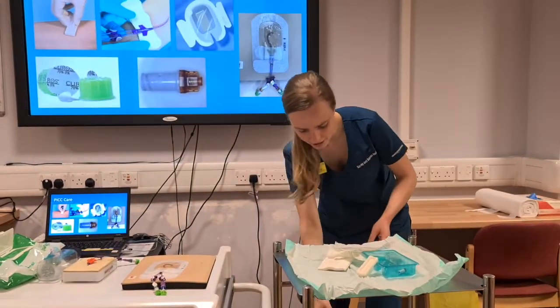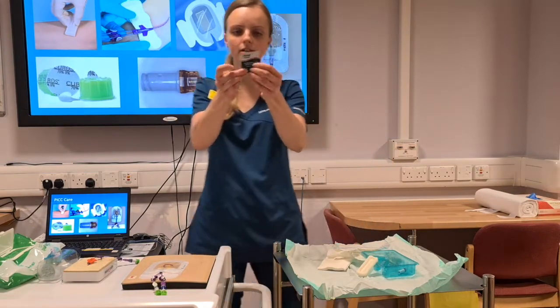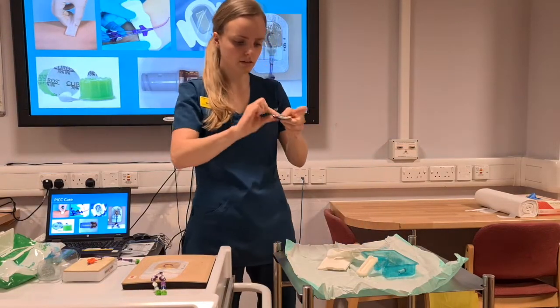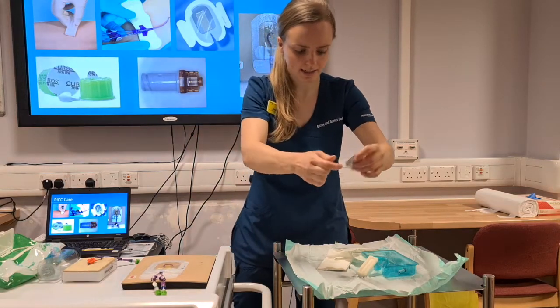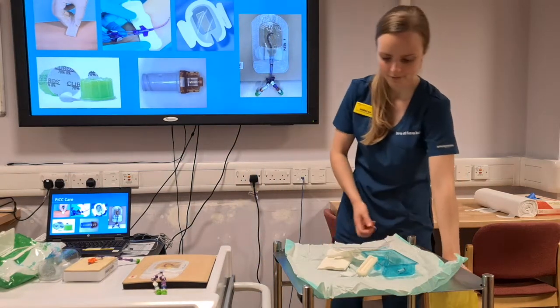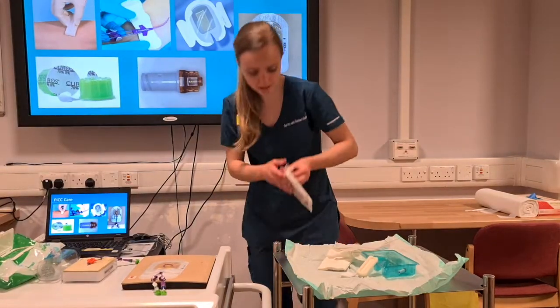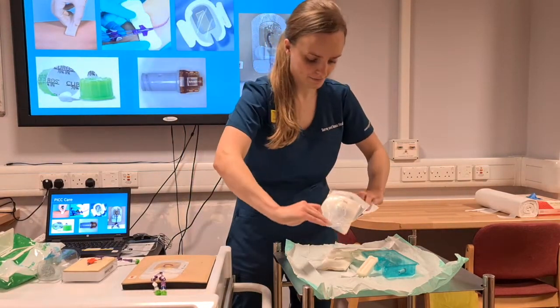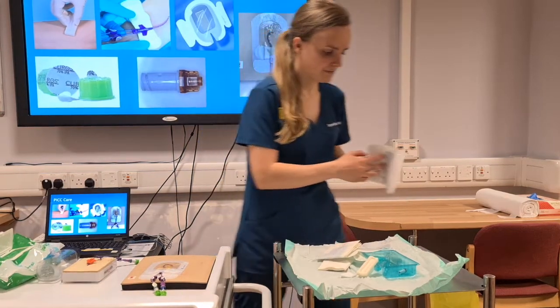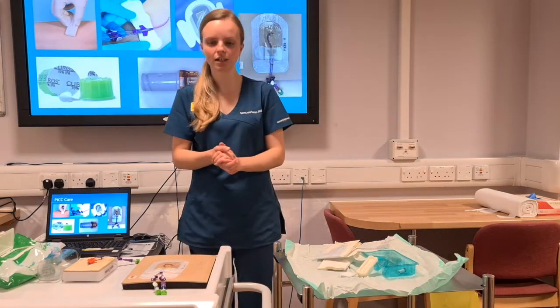Then I have my 2% chlorhexidine wipe. So opening it up, not touching it, and placing it down onto your sterile field. Last but not least, my sterile gloves. So now I'm going to put on gloves and apron.